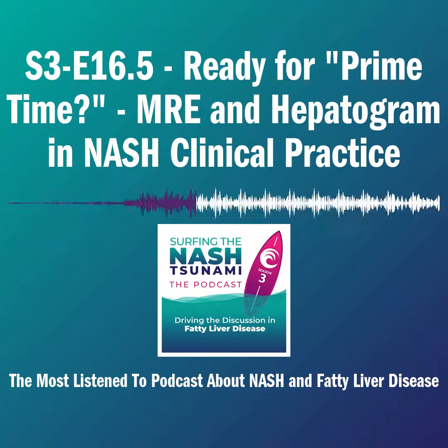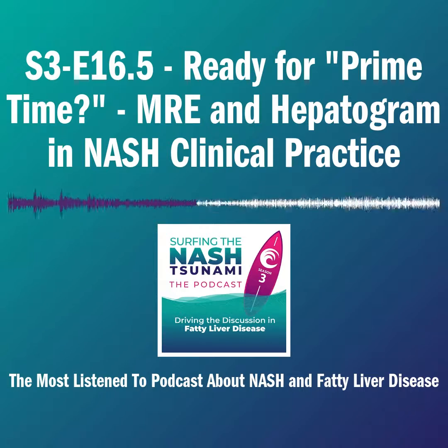In the 2020 paper by Villar Gomez in Clinical Gastroenterology and Hepatology, FIB-4 plus MRE was the most accurate non-invasive test for the detection of cirrhosis and was only marginally more expensive than FIB-4 plus VCTE. That kind of gets into adding MRE to the scanner and ordering it for patients.